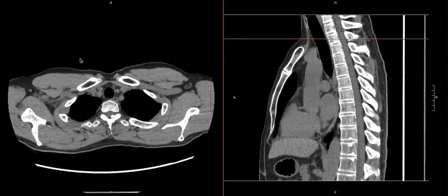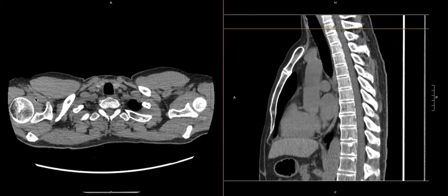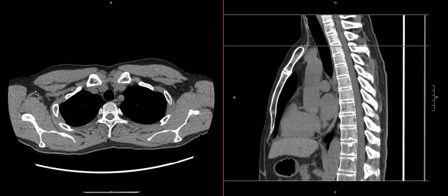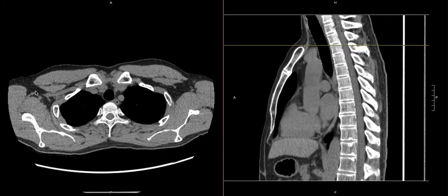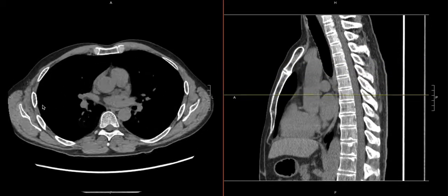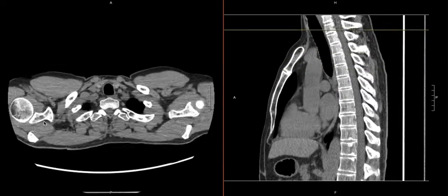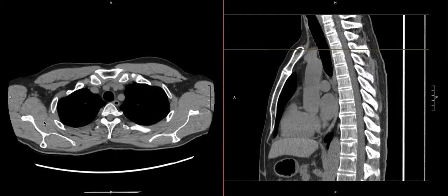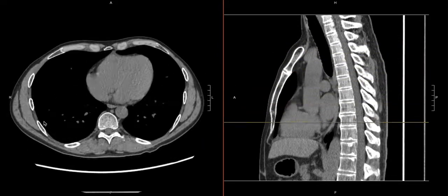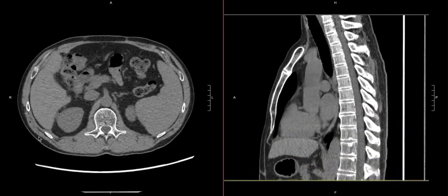As we go back to the top of the scan, now we'll go to our right lateral soft tissues, and we'll look in this quadrant here and come down, paying special attention to the right axilla. These are little lymph nodes that are popping in and out of view. As we scan up and down, this is definitely a very important area of interest to look for axillary lymphadenopathy. Here, all of the lymph nodes are appropriately sized and don't have a suspicious shape, so that's good. And we can scan all the way down and look at the lateral soft tissue surfaces here.